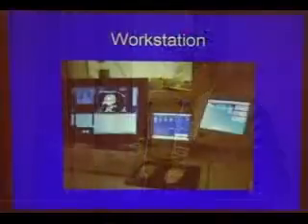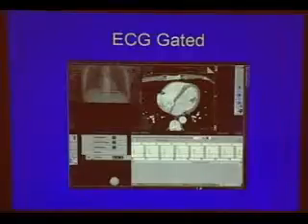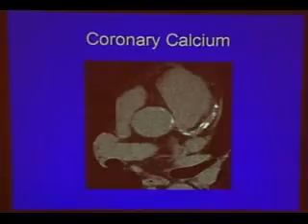Now, this is where we control the computer, and we see the images we obtained. This is a view of the monitor, of the display of the heart, and the EKG trace that we obtain, as you can see, is very regular.